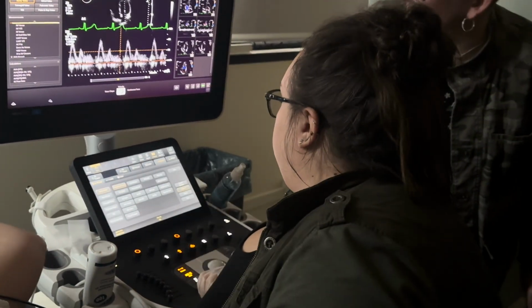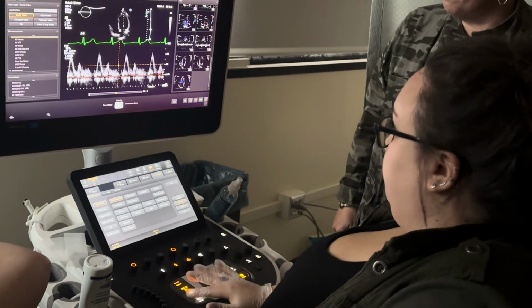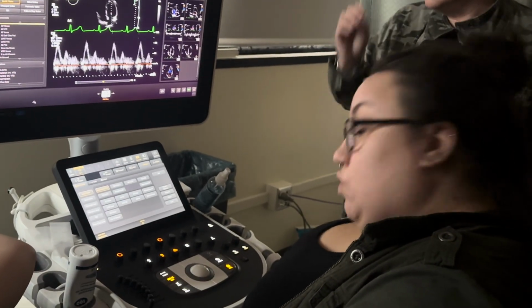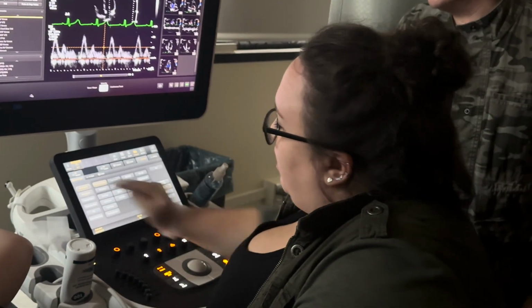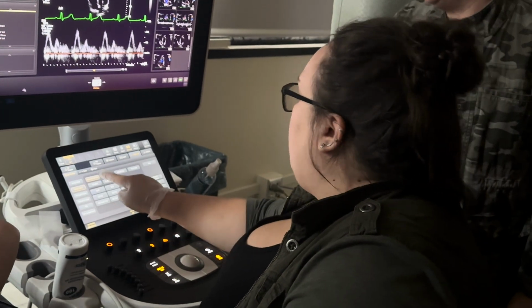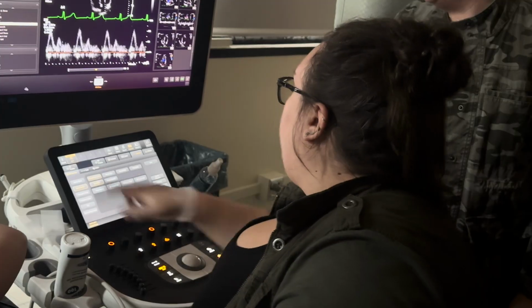What's in our calc package here? There should be an E in there. Okay, let's go back. So, to take an E to A ratio, which you need to do for your proficiency, you will hit measure. Over here, you want to hit mitral valve. Peak, or would it be, this one might be better, right? Because they might do it all. Whatever, we'll do this one.